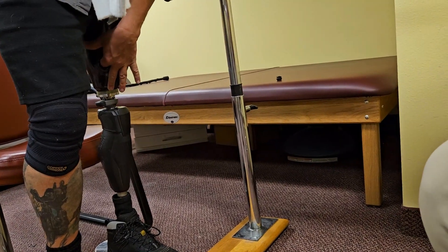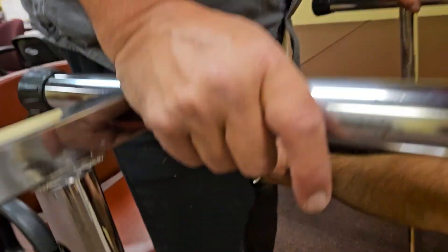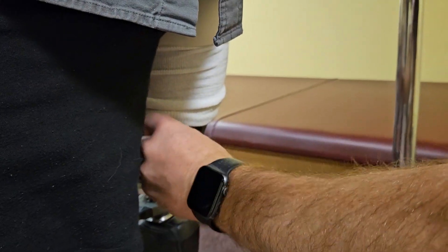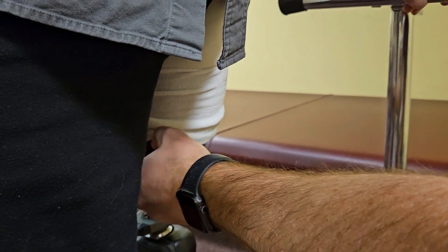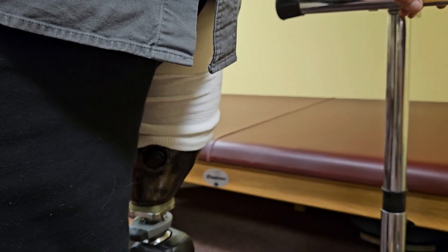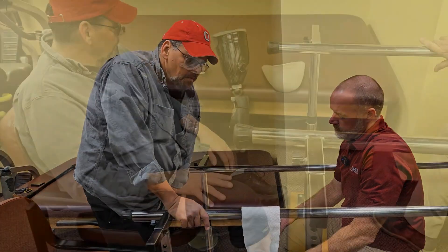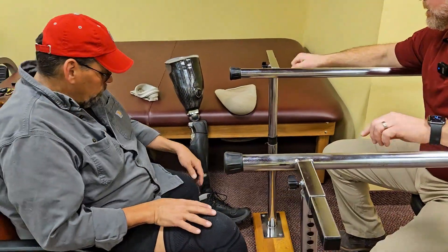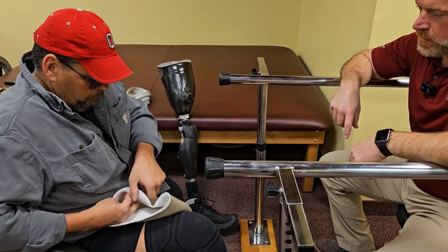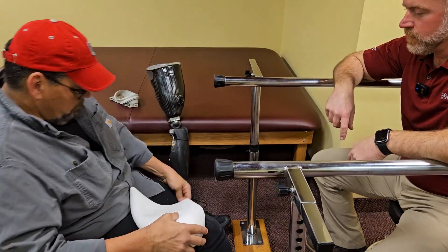At this point, just try to get all that sock out of there. When putting the valve in again, turn it to the left a little — you can almost feel and hear it click to find the threads. If you feel like you really have to force it to tighten, chances are you're not in the threads. If it's too hard, it's not right. Now Lee, it's your turn — I like to call this a pop quiz for patients. If there are any questions or concerns, I'm right here to help.